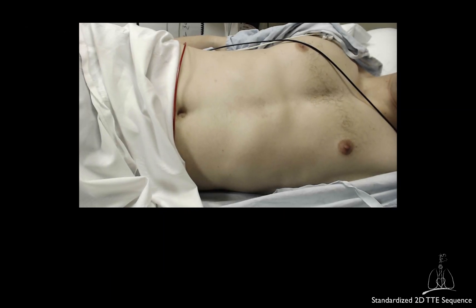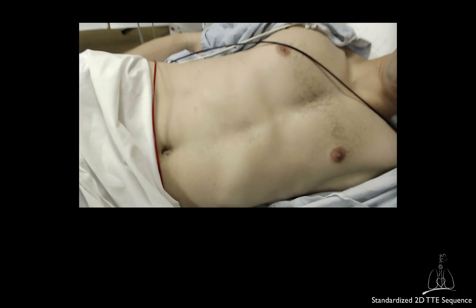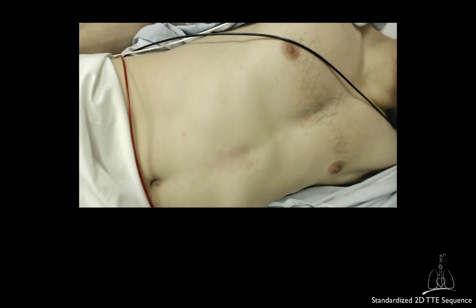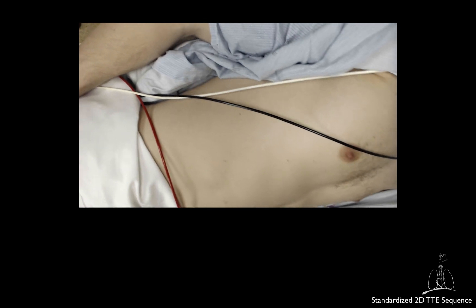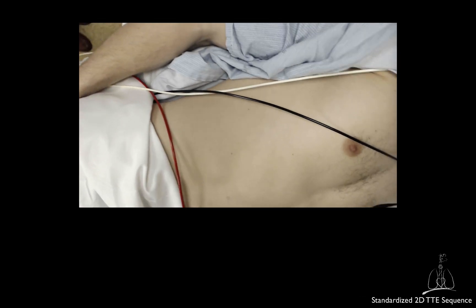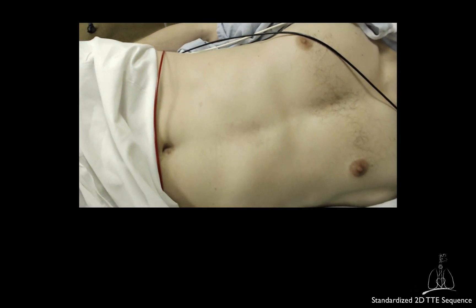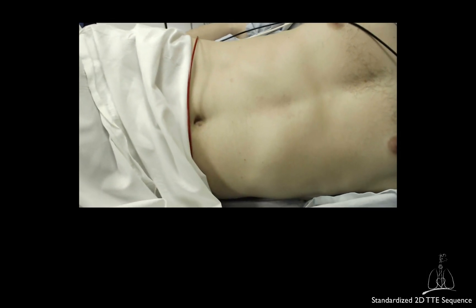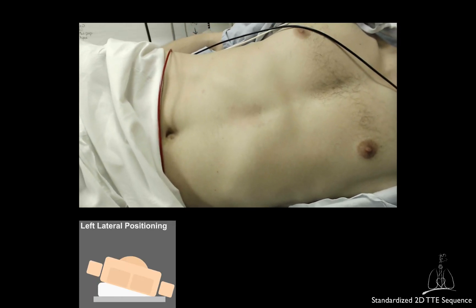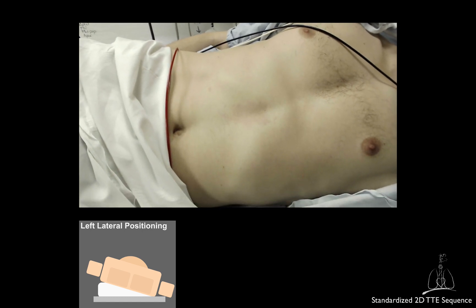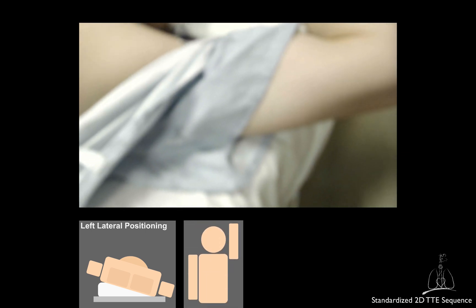A good echocardiographic study requires excellent preparation. Even in the intensive care unit, you should try to position the patient in left lateral decubitus for apical and parasternal windows, unless there is a contraindication such as spine precautions or when inappropriate in case of severe cardiovascular or respiratory instability. The goal is to shift the heart laterally. Often, positioning a wedge or a pillow underneath the right side is necessary to support this position. If possible, raise the patient's left arm above the head to increase the size of the intercostal spaces.